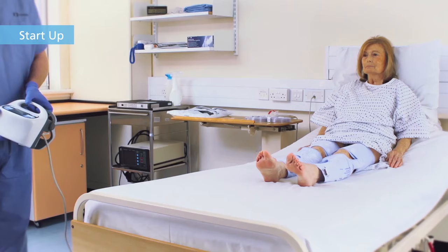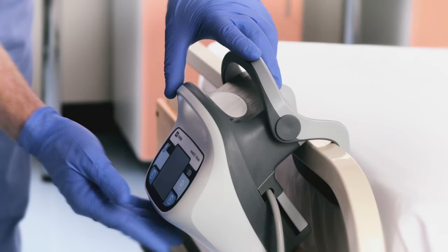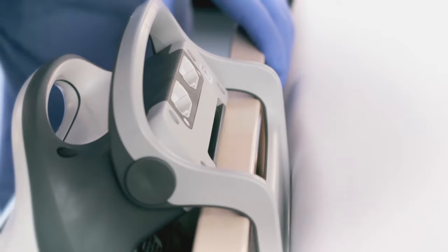Once the sleeves have been placed on the patient's legs, you can prepare the controller. Place the controller on the footboard of the patient's bed. Ensure that the device is securely fixed to the bed and that there is adequate air flow to the vents located at the power cord cover and below the tube set connection points.